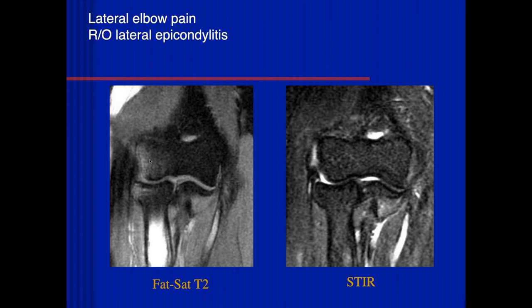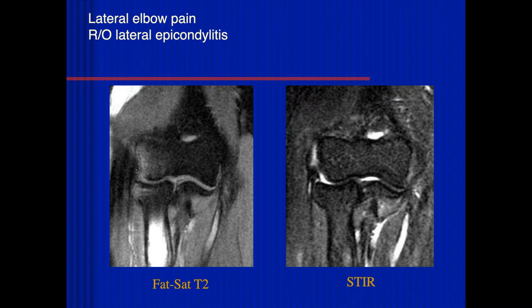There's no signal on the STIR, so that's just incomplete fat saturation. This is due to magnetic field inhomogeneity — there's suppression of the water signal and lack of suppression of the fat signal in those areas, all due to magnetic field inhomogeneity from the coil. Notice that here is a tear of the origin of the extensor carpi radialis brevis tendon, which was a cause of this patient's symptoms, but you can't see it because of all the artifact. If you see this kind of situation, especially in an area where you're suspecting pathology, you have to do additional sequences to get rid of the artifact.